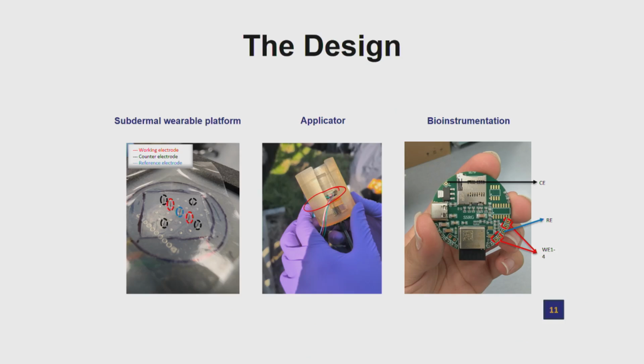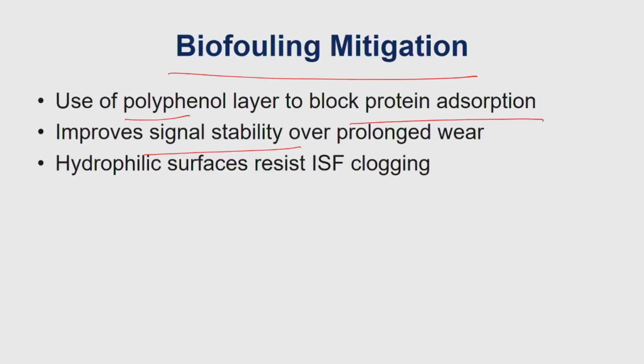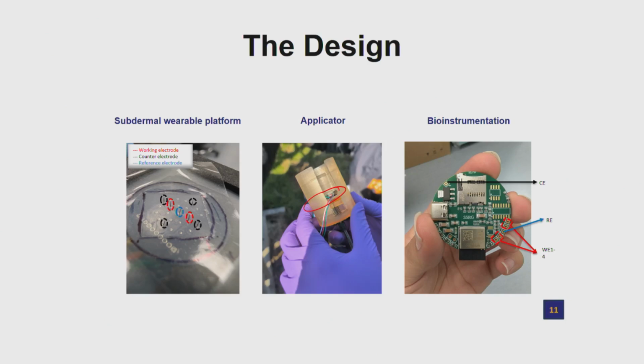As I said, we are using our digital twin to see what the good things are and take those ideas from the digital twin and transfer them onto this. So next time the applicator will have something like what I showed in the video from the animal study. This applicator is for animal studies, but you can use a similar applicator with lower forces and lower speeds in humans as well. It's a very easy way of making applicators.